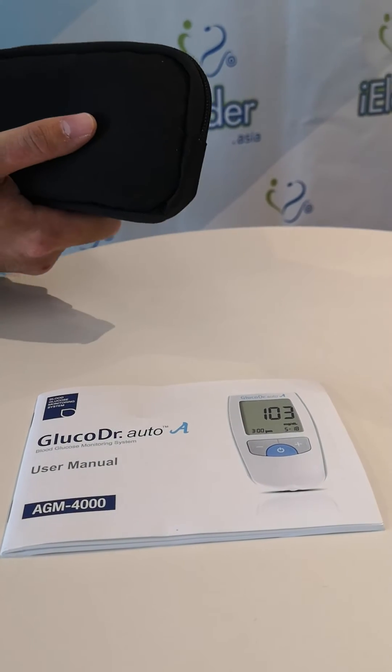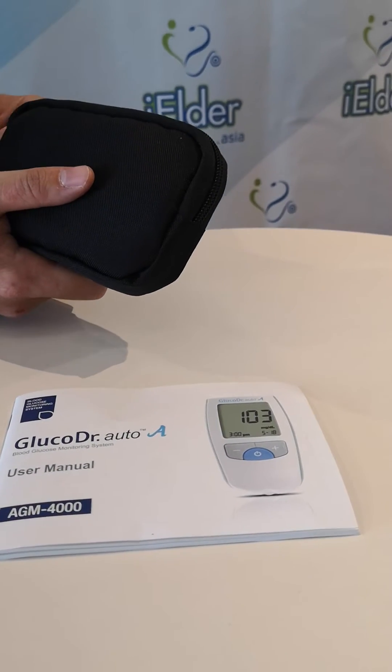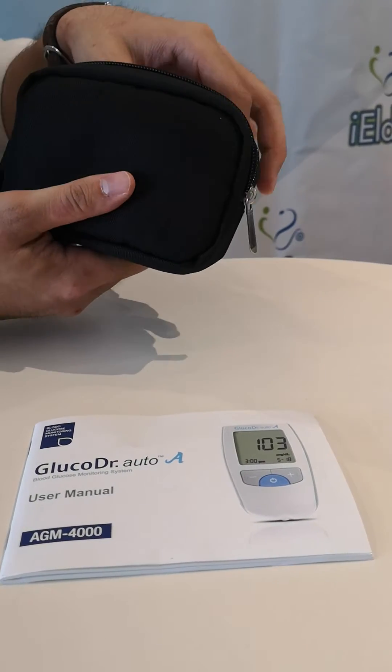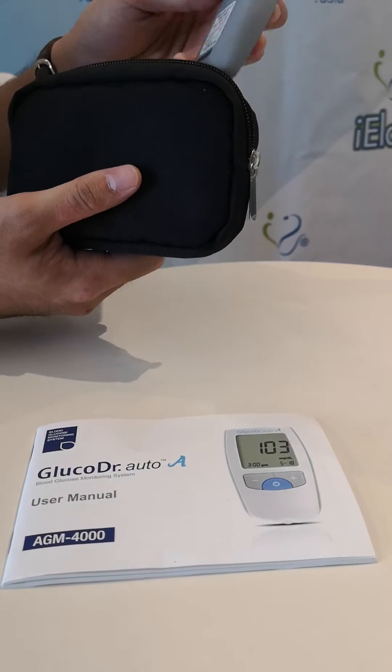Hello everyone. This is the Glucose Doctor glucose monitoring glucose meter — a new glucose meter that iElder Asia is offering.